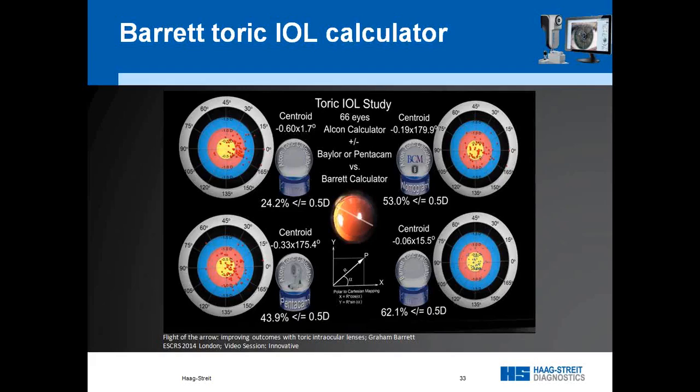But if we then go to real numbers, they tend to be limited. When you do a little test on your topographers and make a measurement a little bit off-center on a spherical eye, you will realize that suddenly the eye looks astigmatic. And I guess that's the reason why we have this improvement with a fixed number as compared to measured numbers, because using the measurement seems to be a little noisy.